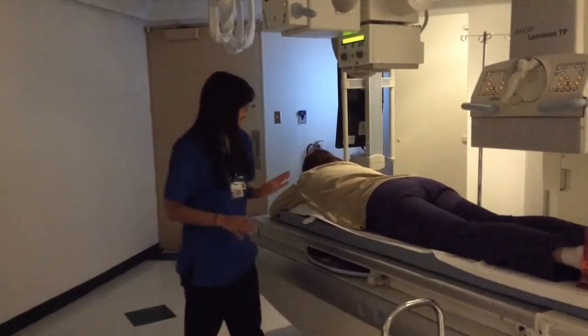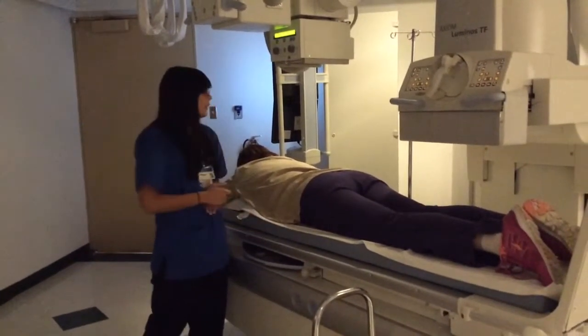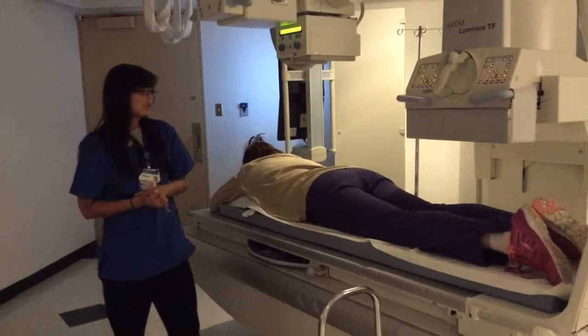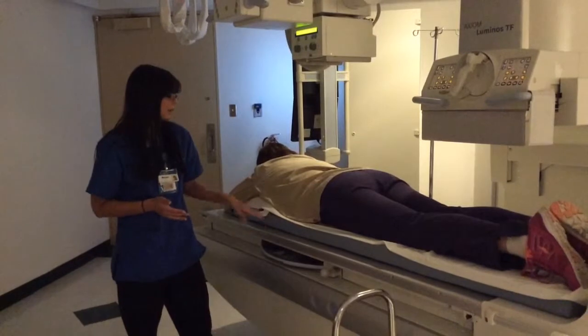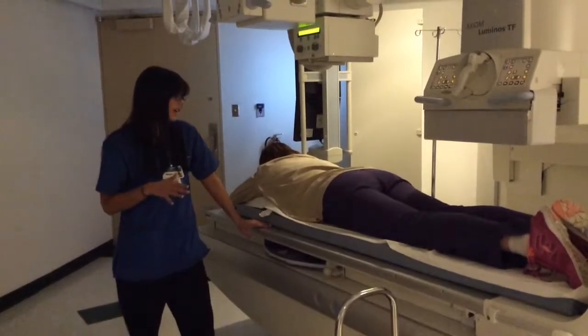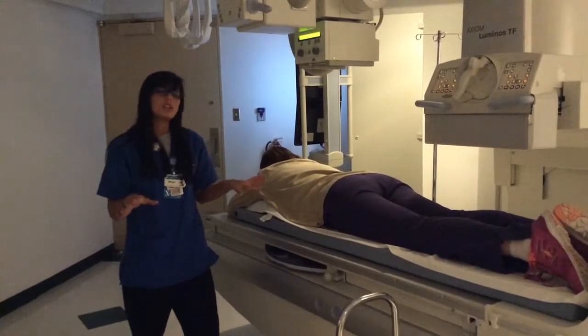After that, I would bring the patient over to the table, lie them prone. Some books say to do an AP projection, but a PA projection is better because it applies compression to the stomach, spreading out the bowels so they're not so overlapped.